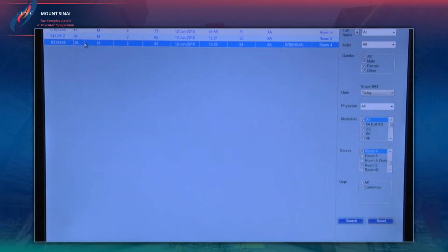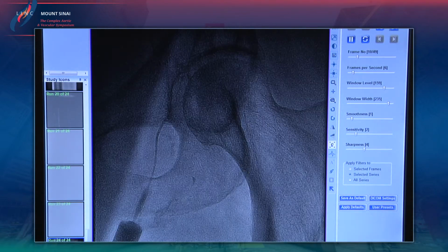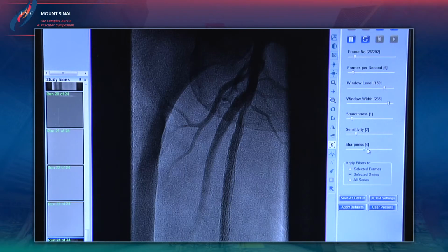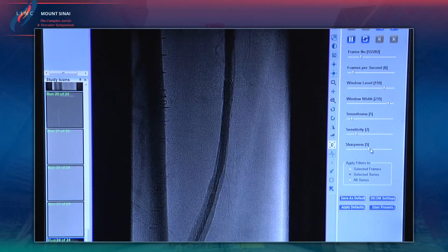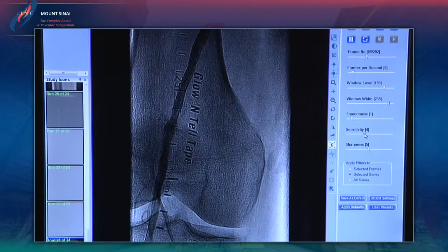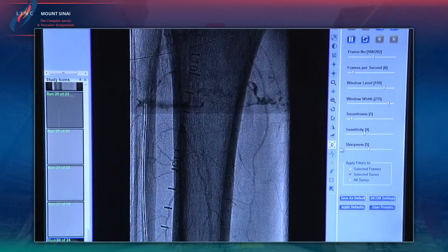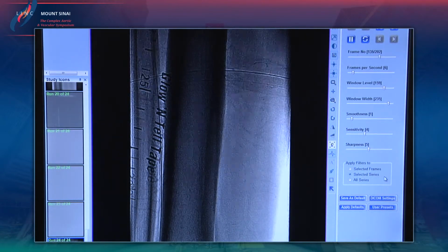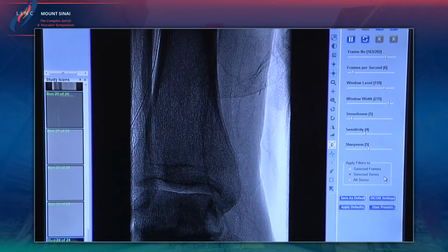Second patient that Dr. Metzger was also part of the panel was the SFA in-stent restenosis, which was thrombotic. So we had done AngioJet, and then we had a discussion regarding what to do next because there was no flow. Dr. Giancarlo and I felt that there was more of a recoil issue, so we went ahead and decided to put Zilver PTX, and you can see here with our final picture, there was excellent flow. The IVUS showed there was some grumous material in the mid SFA stent that you'll see here.